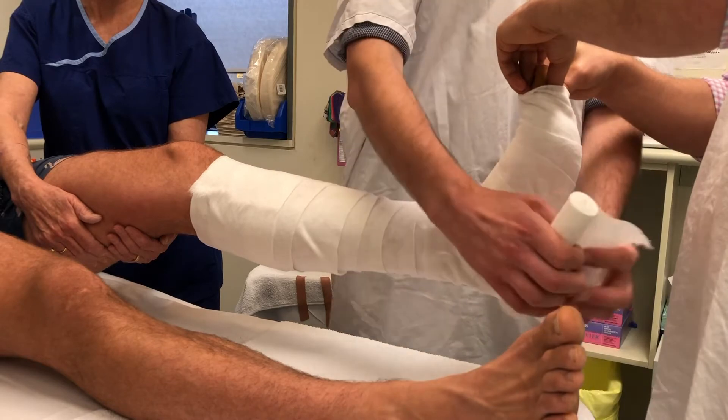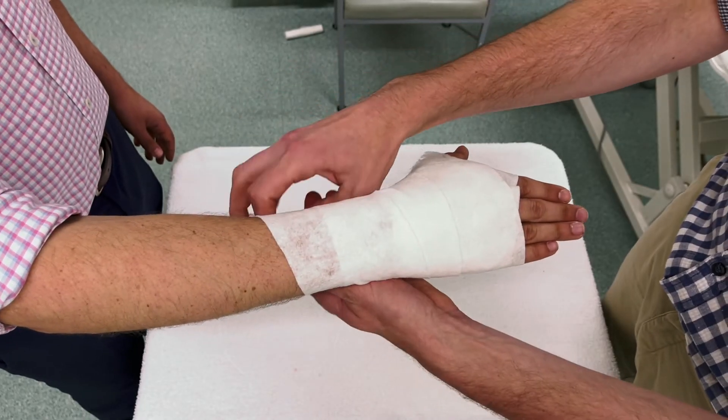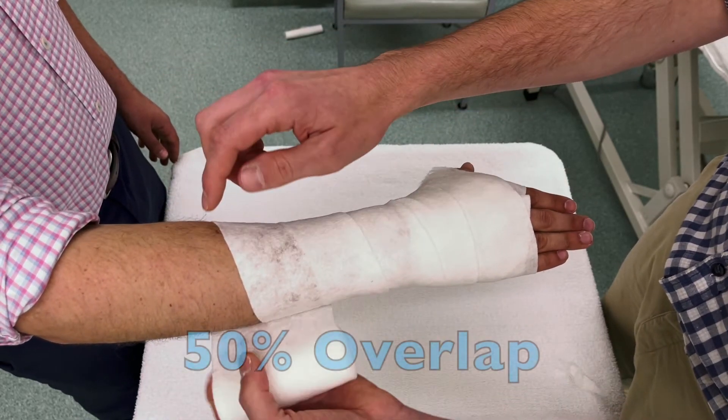Make sure you pad the bony prominences well — for the ankle, that means the calcaneum, the malleoli, and the tibial tuberosity; for a wrist, the ulnar and radial styloids. This is particularly important in diabetic patients with peripheral neuropathy, where you can end up with pressure sores over bony prominences. On the flip side, don't use too much padding if you're doing a reduction — about two layers maximum, meaning each pass only covers the previous layer by half.